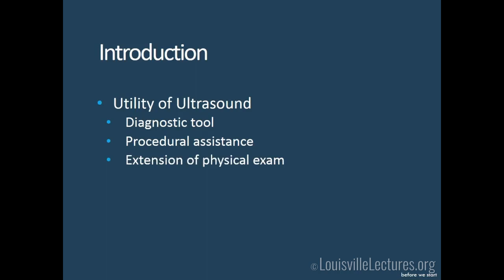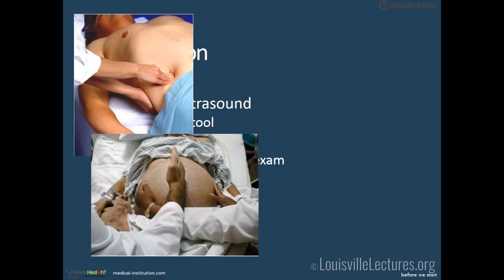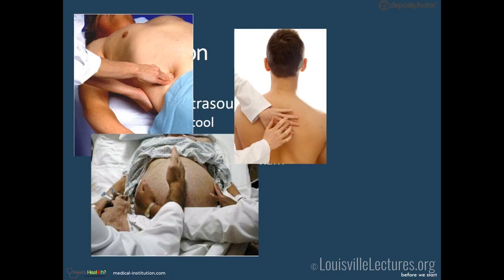The most important thing for me is that ultrasound extends my physical exam. If I can feel something in a human body, I can put a probe on it and characterize it better. For example, you can do an ultrasound of the kidneys to see if they're enlarged. With ascites, instead of doing a fluid thrill, you can put a probe on and find how much fluid there is and locate a pocket to tap. Percussing for pleural effusions — ultrasound can tell you what you have and give you the differential for the fluid.